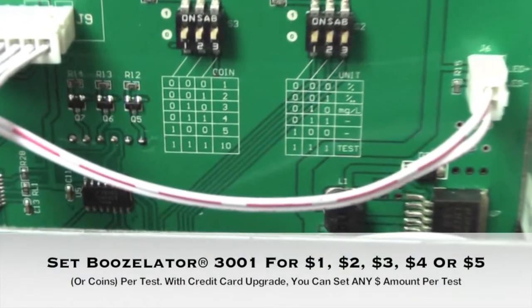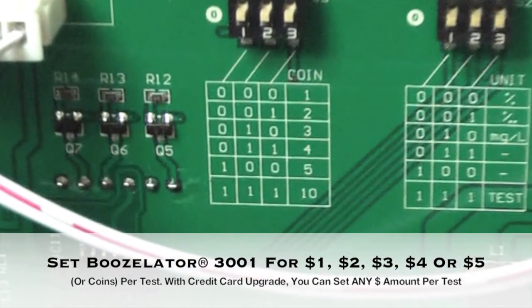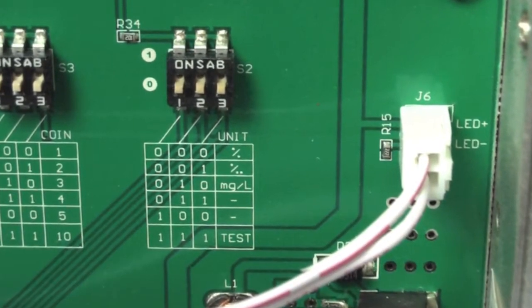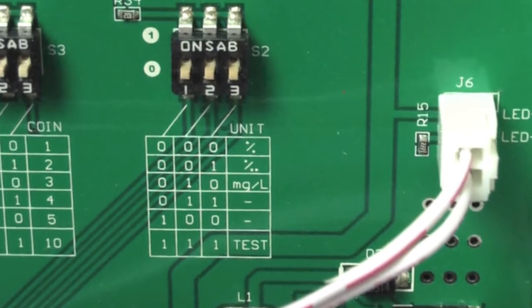Here are the switches you will use for changing the dollar or coin amount per breath test. You can charge anywhere from $1 to $5 per test. On the set of switches to the right, this is where you can set the machine to read the standard in your country. In North America, the standard is percent BAC.